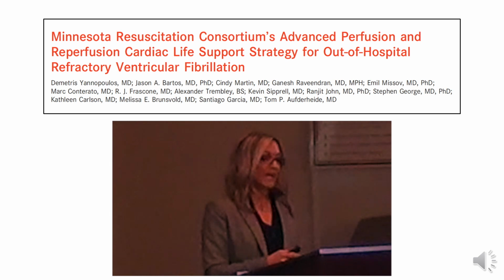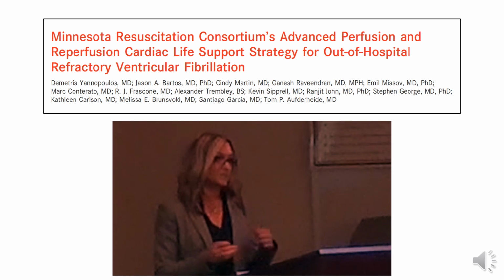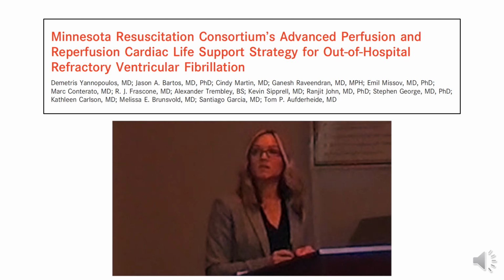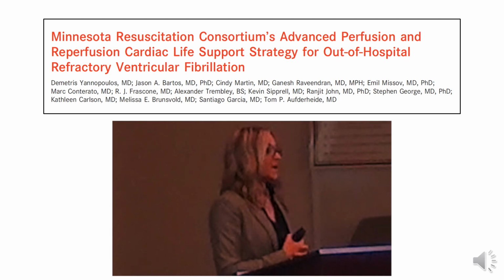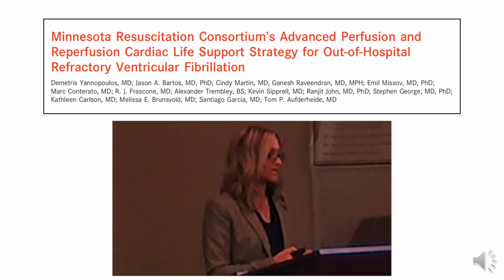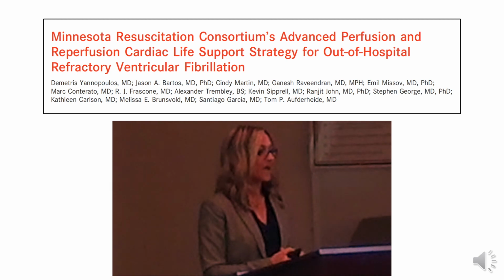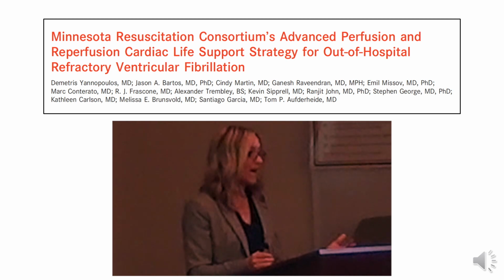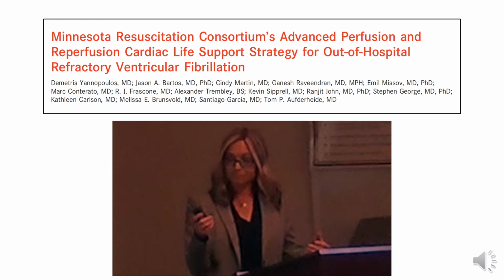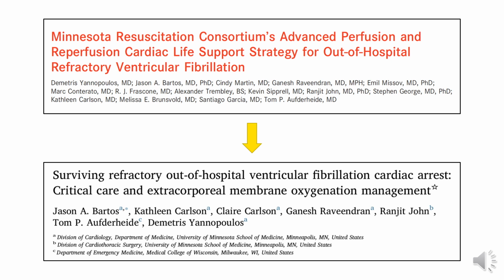The final study that came out most recently is the one that is affecting pre-hospital ECMO and ED ECMO most. Minnesota put together a pre-hospital ECMO program. They had 3 different agencies that brought patients to their hospital. They bypassed the ER. They went to the cath lab. The cath lab was waiting for them to be cathed. It was a perfect setup. Their initial study published 27 patients. And then 3 months ago, they published another study, and they released statistics from the first 100 patients they cannulated.